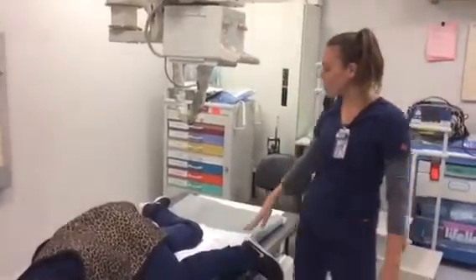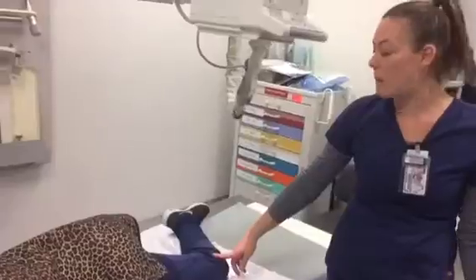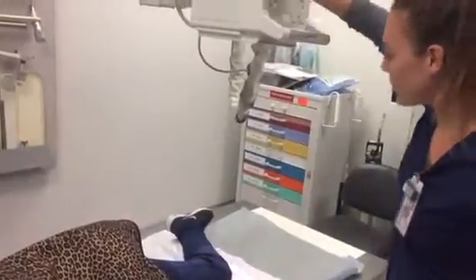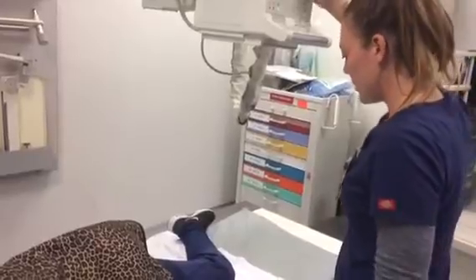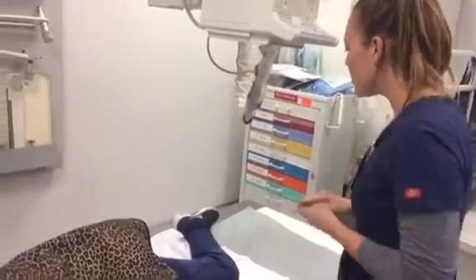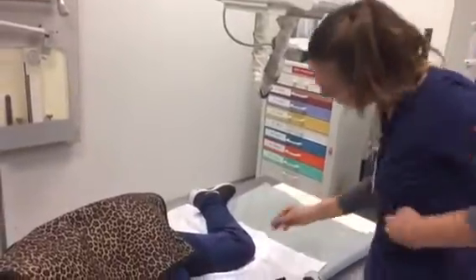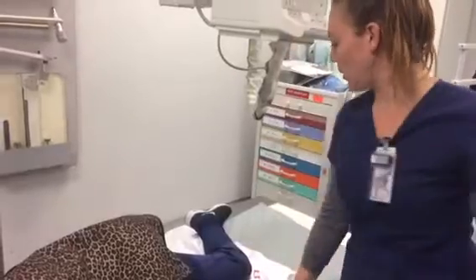For this projection, we're going to have the CR 1 inch distal to the medial condyle. We want the condyles perpendicular to the IR. We also want to collimate down. And of course, mark our image. All right, same technique, 5 degree cephalic tube angle. All right, don't move, X-ray.